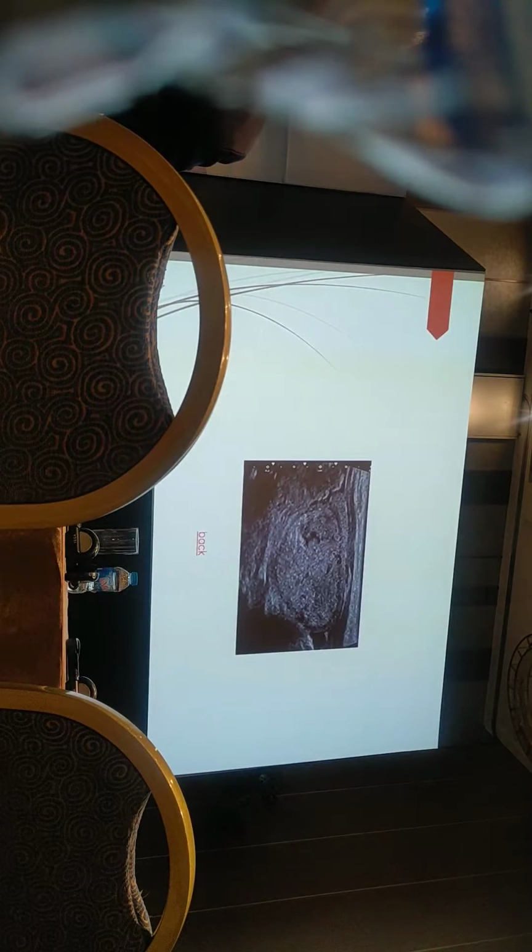Sorry. Here, I'll show you the picture. We can see that this is the ultrasound of the thyroid scan. It demonstrates a circumscribed heterogeneous nodule in the thyroid. We find a spotty echogenic fragment within the nodule, and the pathology findings confirm this is a papillary carcinoma.